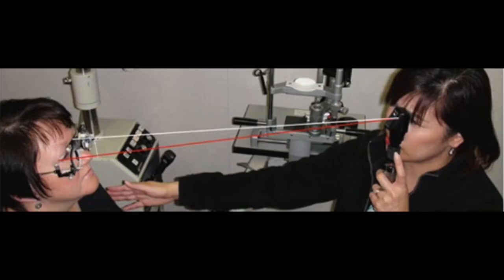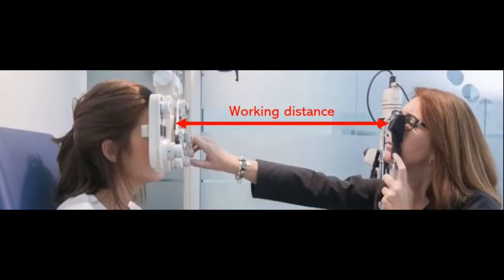As the name suggests, working distance is the distance at which we work with the retinoscope. We do not stand extremely close to the patient, neither do we stand far away. We are at an optimal distance, usually that of one hand from the patient.